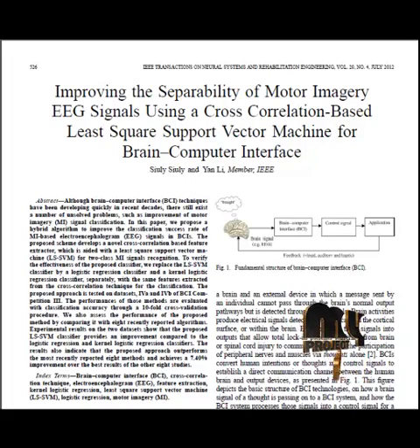Then the features are extracted from the signals using the cross-correlogram of the input signal and the reference signal. The cross-correlogram signals convey greater signal information and consist of low-level noises compared to the original signal. A cross-correlogram contains information about the frequencies which are common to both waveforms, one of which is usually the signal and another one is the reference. The values that we got by applying the cross-correlogram become the feature of the signal.